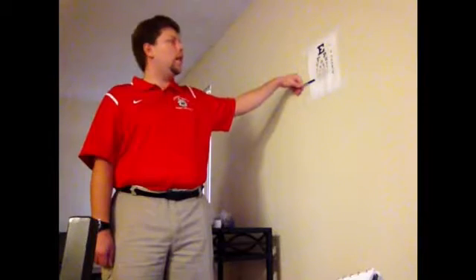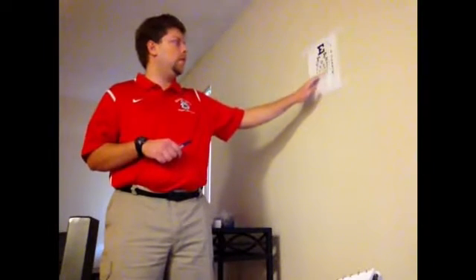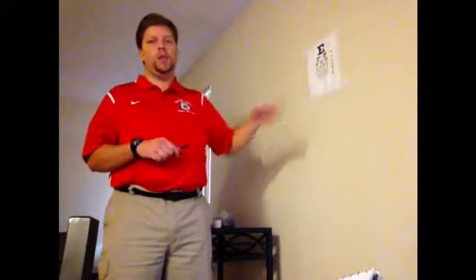DPZO. Okay, and so same result there. A couple of errors on line 7, so I'm going to give him the measurement for line 6, which is the same thing, 20/30, which means he can see at 20 feet away what most people can see at 30 feet away.